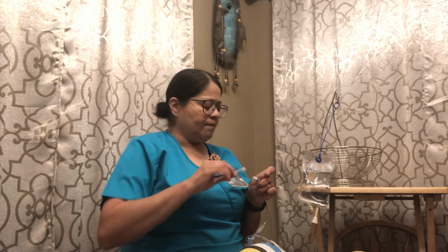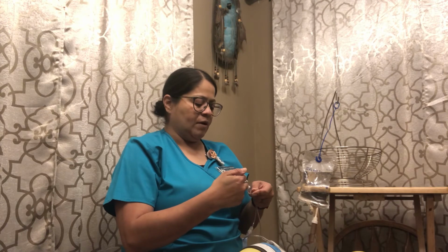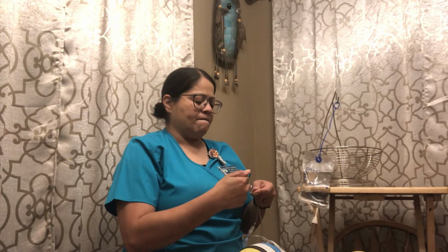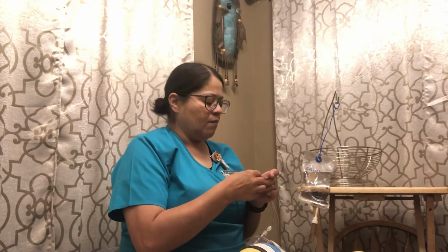Then I'm going to go ahead and get my solution, my medication. Just prime it a little bit to the top. Place it in here. I still have the top pinched, and so I'm going to inject 0.5 mL slowly. And then wait a minute. The minute has passed. Do another 0.5 mL slowly. And then wait a minute. The minute has passed. So I'm going to go ahead and clean my port again.